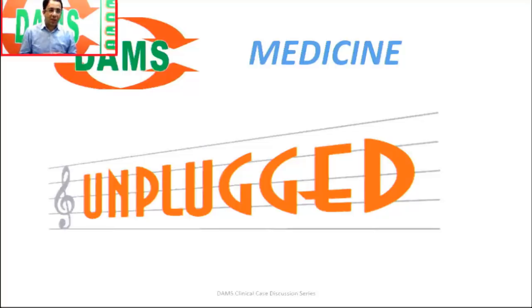Hi friends. Now we have initiated a series on YouTube and Damseli page on Facebook called Unplugged, where we discuss common clinical cases, sometimes some uncommon cases, sometimes an X-ray, sometimes a pathological image, and we try to help you correlate them with a multiple choice question here.